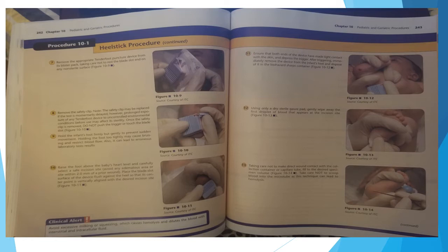Hold the infant's foot firmly but gently to prevent sudden movement. Holding the foot too tightly may cause bruising and restrict blood flow. Also, it can lead to erroneous laboratory test results. Raise the foot above the baby's heart level and carefully select a safe incision site. Avoid any edematous area or site within 2 millimeters of a prior wound.